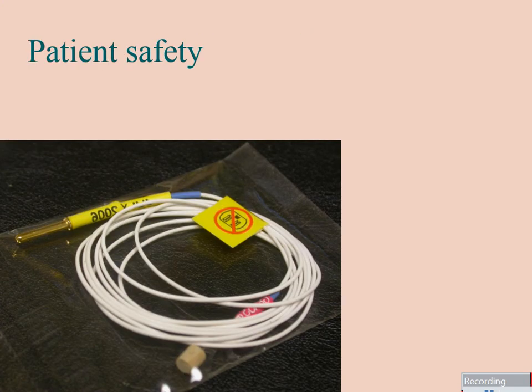Now, another big concern is patient safety. They've now redesigned these plugs so that you cannot plug them into an outlet. But believe it or not, somebody took electrodes from an EEG and plugged it into the wall socket and electrocuted the patient. And so now they had to put on the electrodes, don't plug these things into the wall, and they've changed them now so that you can't even physically do that.